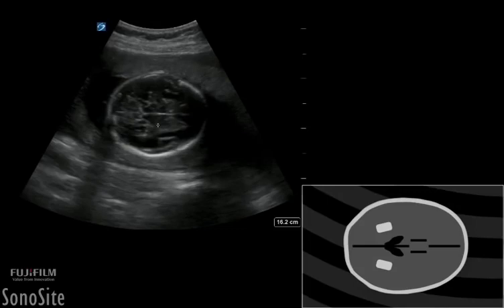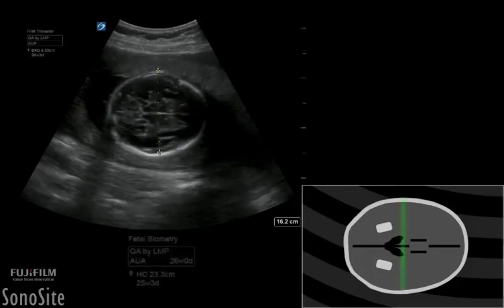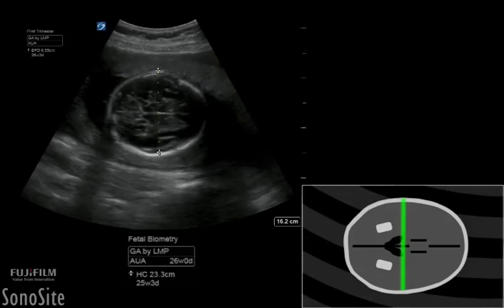The biparietal diameter is measured at the greatest width of the fetal head in an ear-to-ear fashion by placing the calipers from the outer edge of the proximal parietal bone to the inner edge of the distal parietal bone.